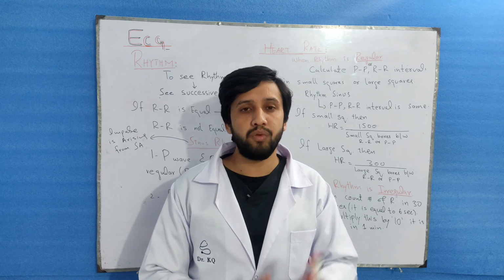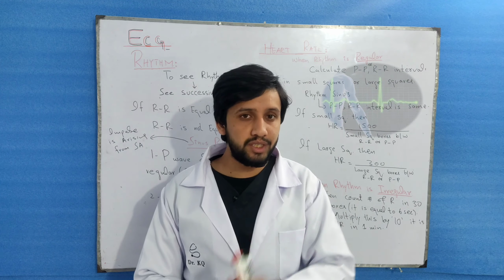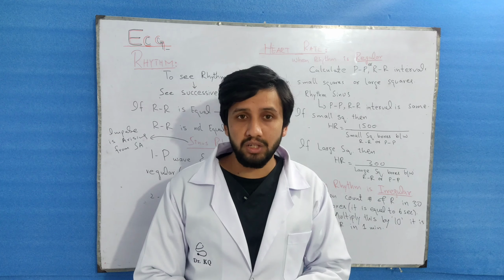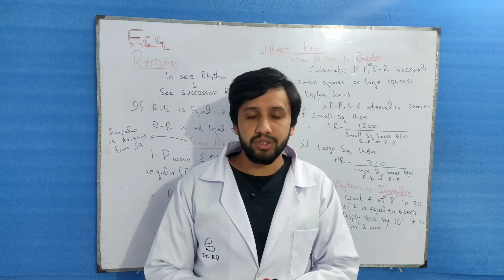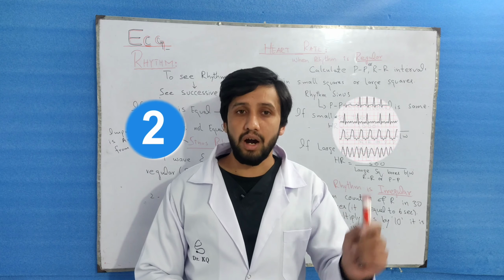Kashan Kasur. Today we were discussing the ECG of the heart, in which we have discussed the basics of ECG, like the P wave and QRS complex graphically. Then we have also discussed the ECG paper and finally the ECG leads. So today we are going to discuss two topics. Number one is the heart rate, second one is the heart rhythm.